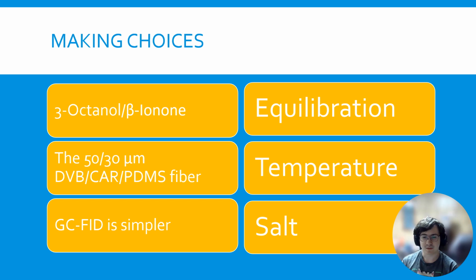And this step is what will actually impact the end goal the most, because different changes in these equilibrium conditions matter. Like I said, it's an equilibrium constant based process. So changes in environmental conditions change the equilibrium constant, which changes the equilibrium and changes our final result, which means that our concentrations won't be as accurate.